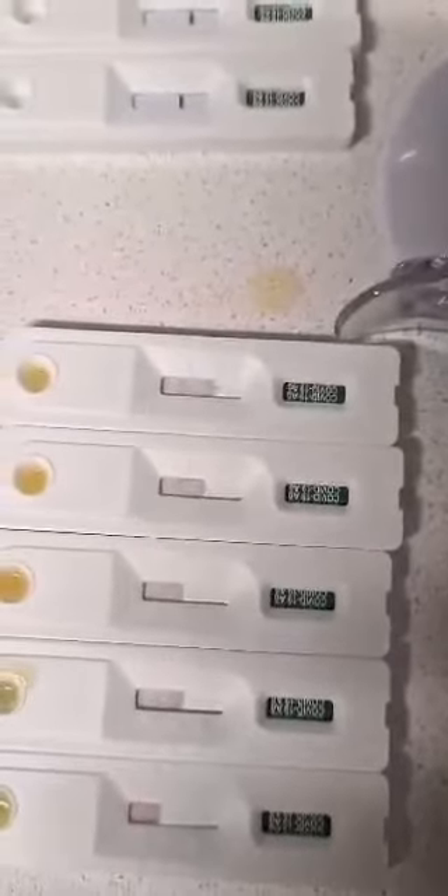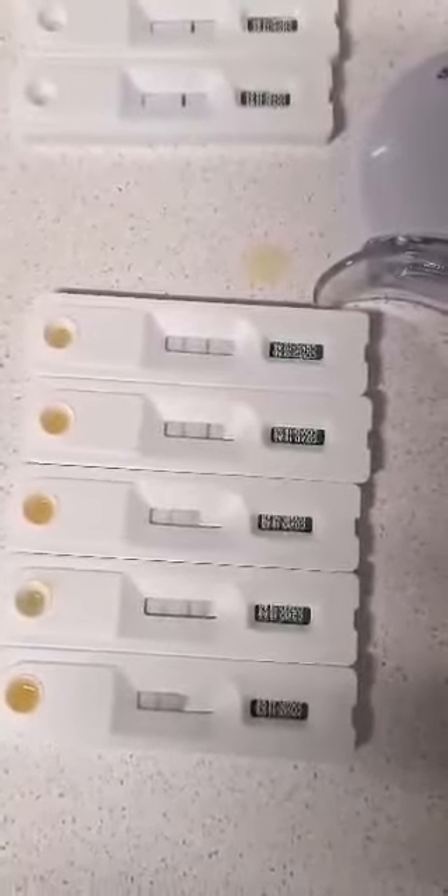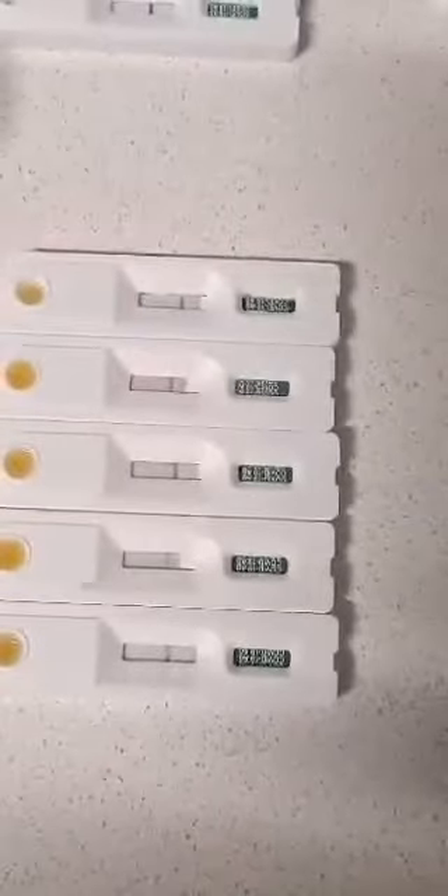All right, here we go — wow, look at this! Got positives everywhere. See, the C is control, T is for positive. These ones look like they're almost all positive — different batch — these ones look almost all negative. These are the same batch, these are the same batch. There are three that have absolutely faint lines — those three there. Those top two I can't see lines on. And as you can see, those are all positive — all orange juice. There you go.